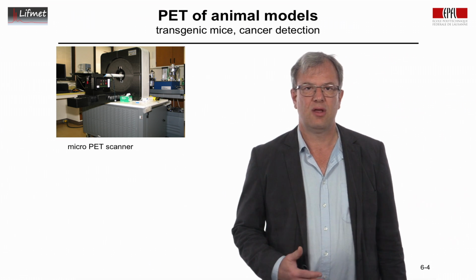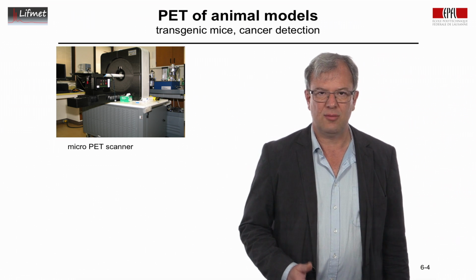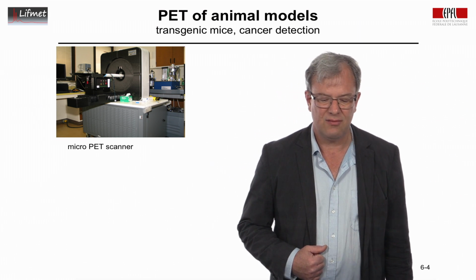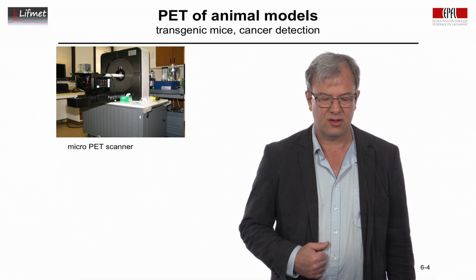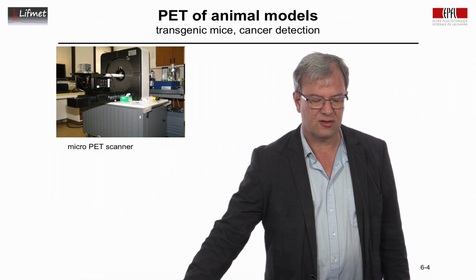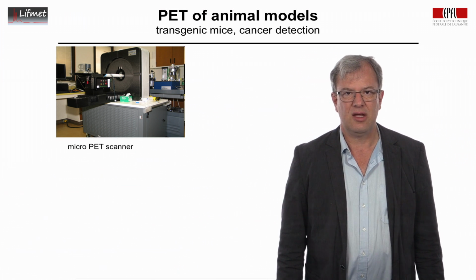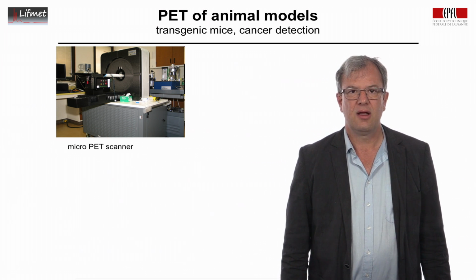As we've seen with CT or SPECT, the scanner that is used for animal scanning is smaller. It's adapted to the smaller size of the species being investigated, and this is the standard approach here. Interestingly, they still cover up the electronics. It's probably more for the protection of the electronics here, rather than appeasing the volunteer here, who is an anesthetized rodent.